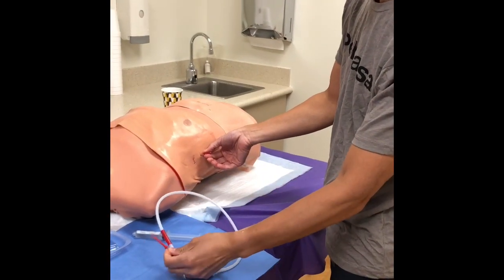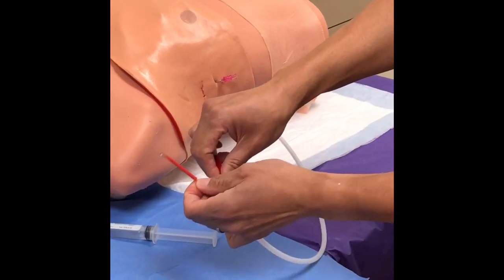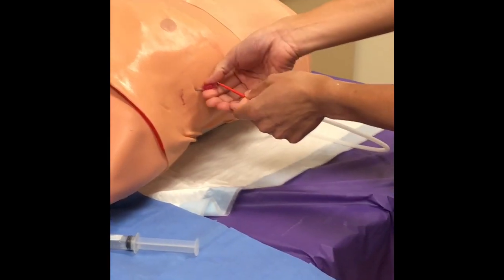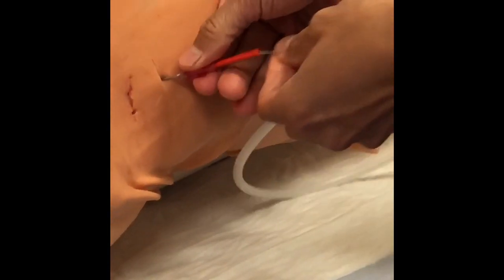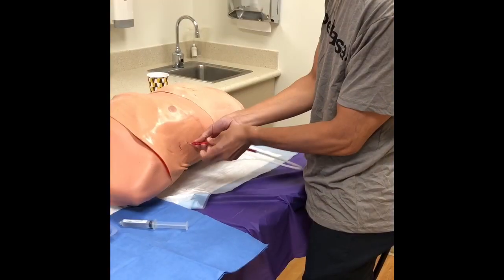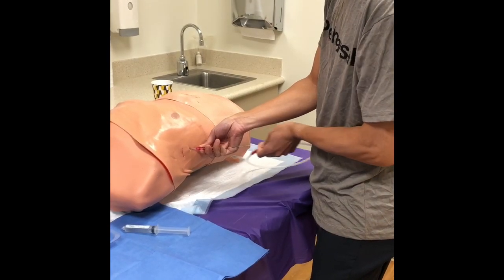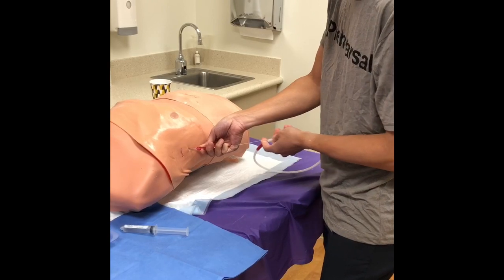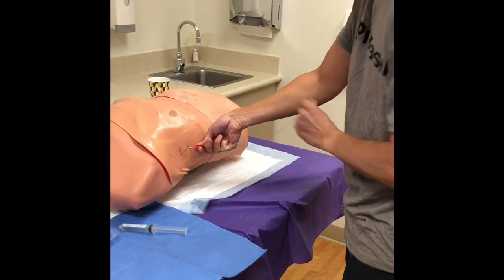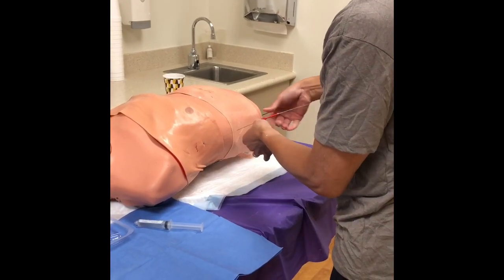Once you're confident you're in, start cannulating the guide wire. These guide wires have a special safety feature — use your finger to straighten it out, which helps if you have a tremor. Feed the guide wire in; it should go in pretty easily. The tip is soft — never stick the hard end in, as that will puncture something.